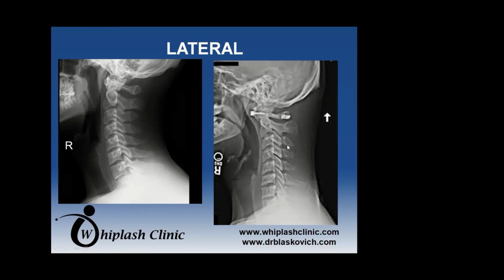Okay, so yes, a reverse lordosis is one of the most important findings when looking at a cervical spine X-ray, because that'll tell you that this person has had whiplash, 100%, and that their muscles have been undergoing some level of splinting for whatever amount of time from that whiplash to the point that they might be seeing you for a massage. And therefore, doing something that would accentuate the lordosis in a mild way while treating them will actually be very, very blissful for them.